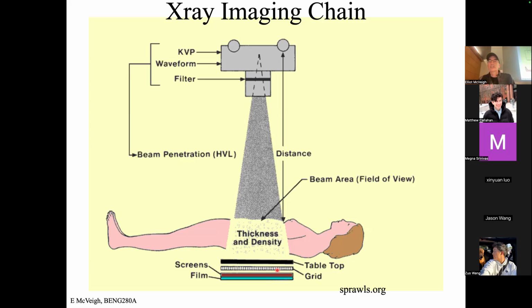So the question is, if this is going to work, then the detector and the emitter would have to be in a constant orientation for that anti-scatter grid to work. That is actually true. So when I go to the dentist and they put that stupid thing in my mouth, and I chomp down on it, and I have an X-ray beam pointed at my head, what happens with this scatter grid?